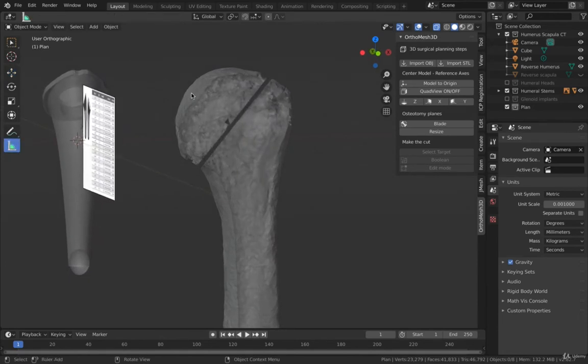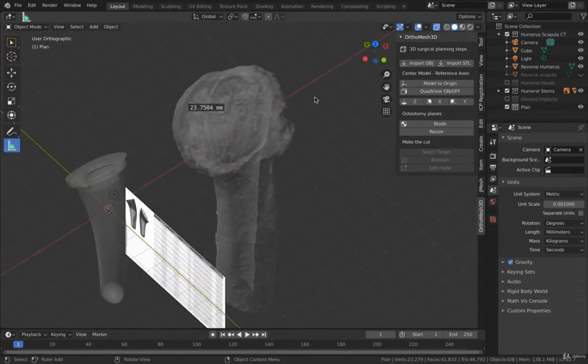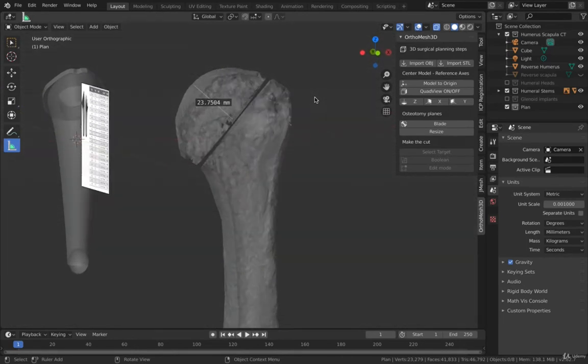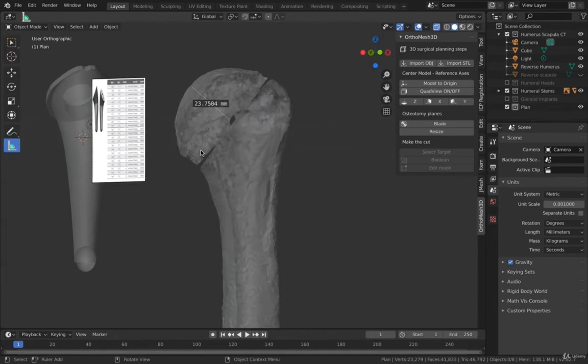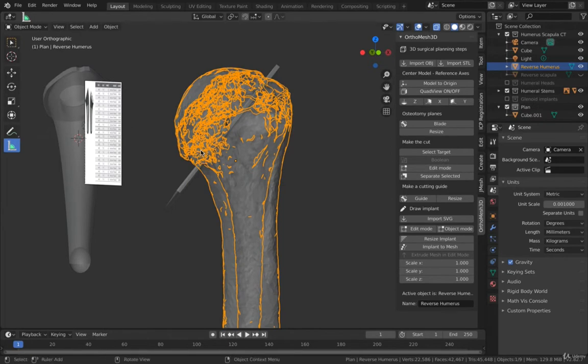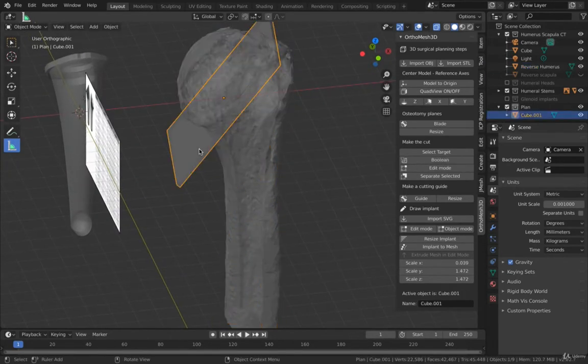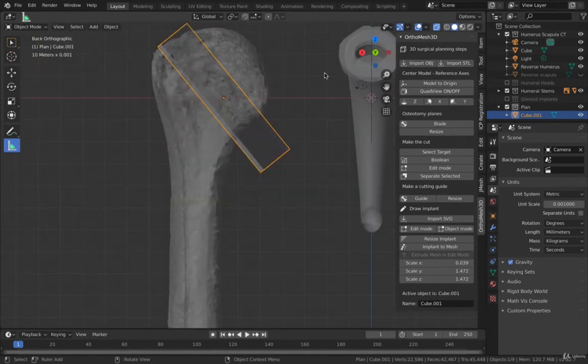We can take the ruler and measure from the top to there, and make sure we rotate and we have a good view, and it's about 23 millimeters of resection. We are very close to the cuff here, as you can see, and also maybe a little bit of a vertical cut. If I want to correct this, I can just go Command Z, Command Z, Command Z, and here's my blade again, and I can just move it some so I don't have such an aggressive cut.